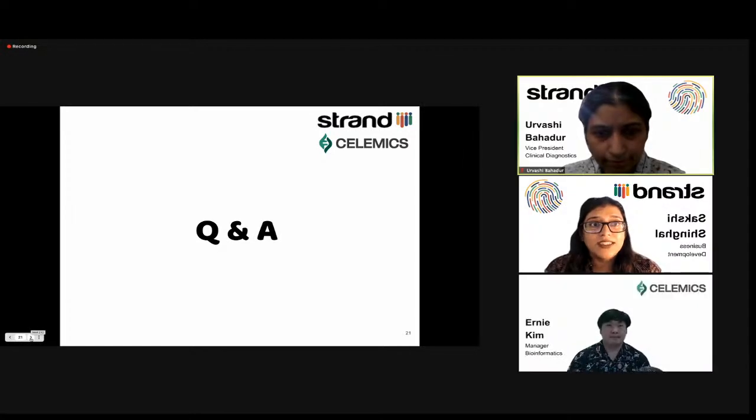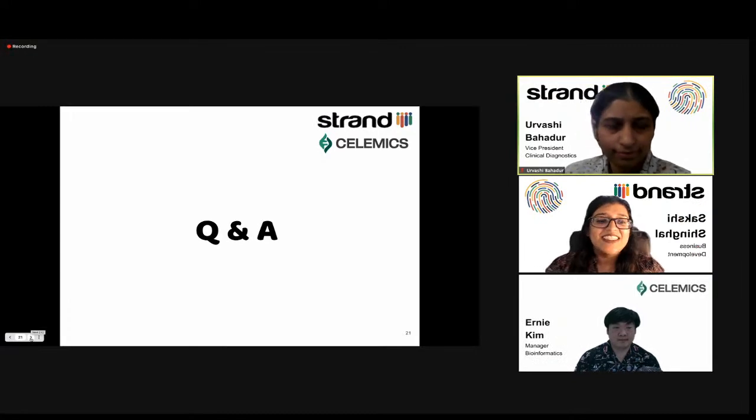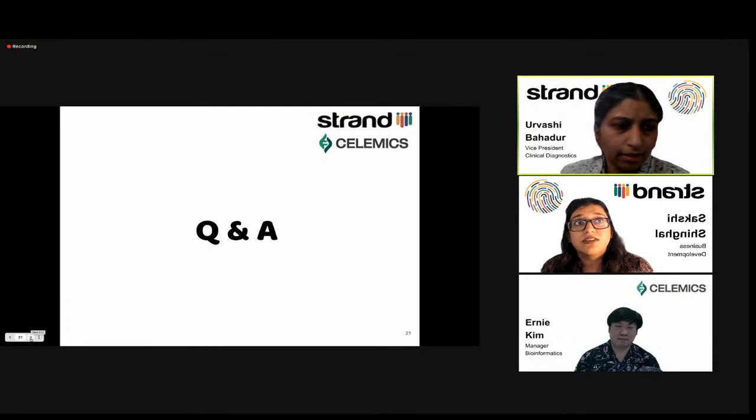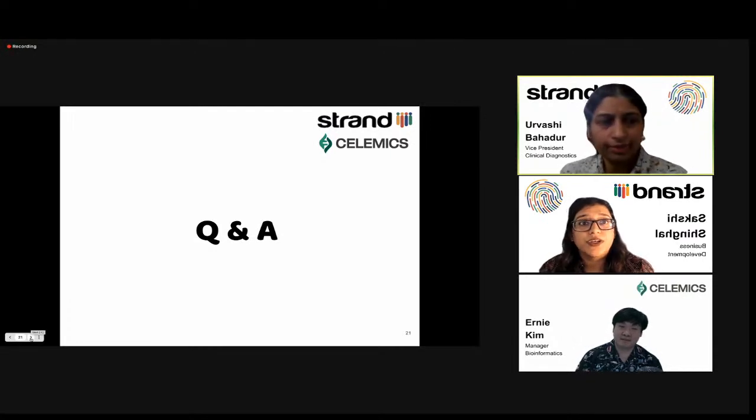So the first one is from Violetta V. I hope I'm pronouncing your name correctly. She asks, what is the annotator used to annotate the variants coming from the VCF file? If either you or Rishi or Ernie could take that.